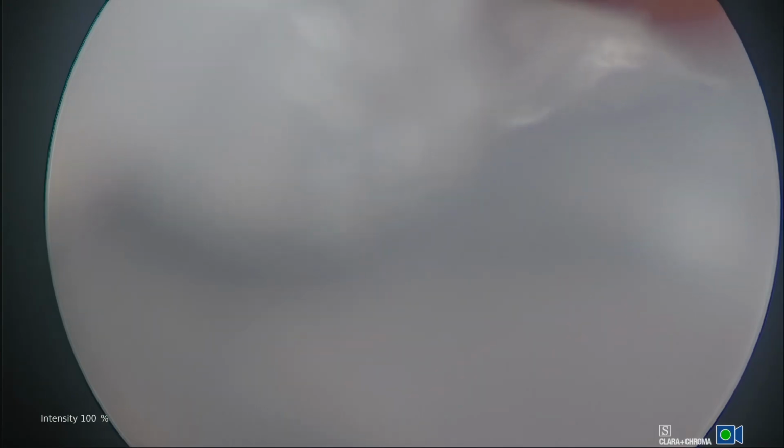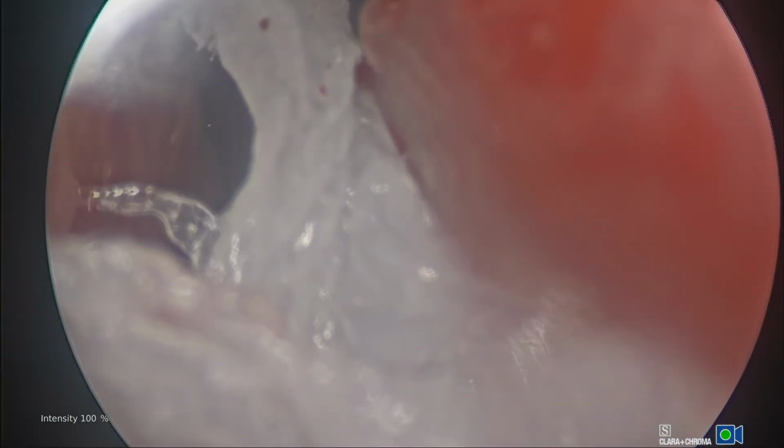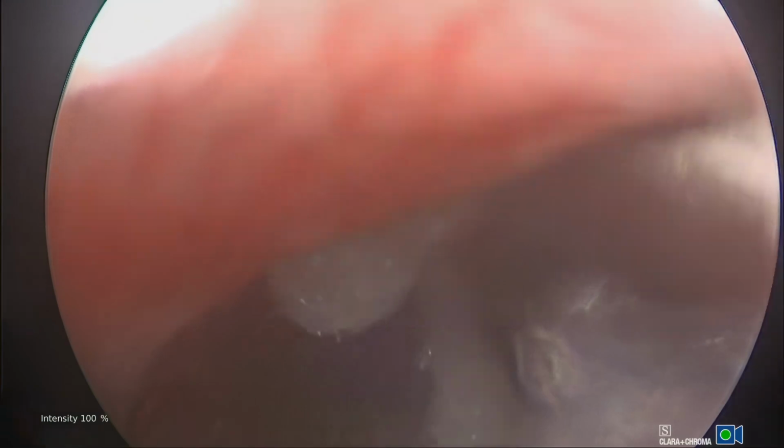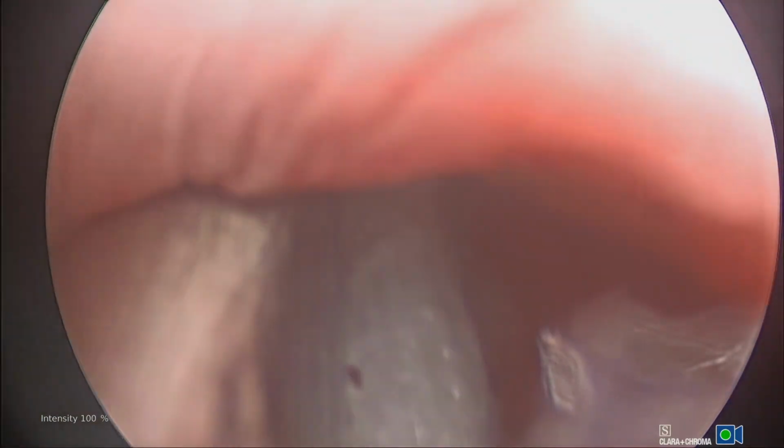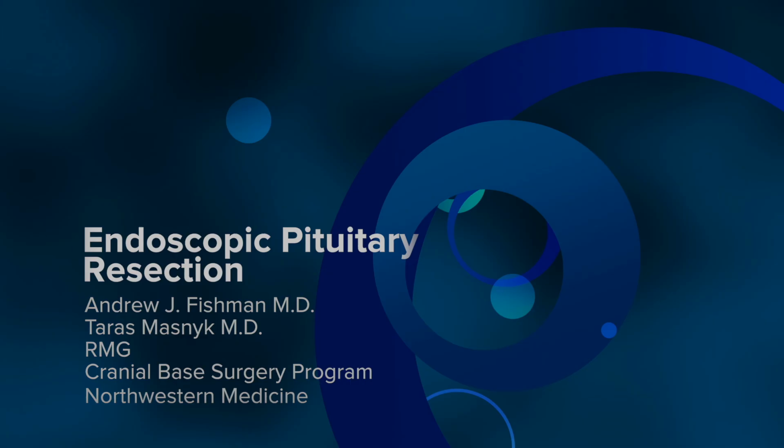cavity to allow for a good, nice opening of the nasal vault during healing. If you rely on dissolvable packing, the healing tends to be delayed and the patient usually requires a prolonged period of debridement. While using this dual flap technique to cover all of the fat and to provide a nice open supported cavity, this minimizes the need for post-operative debridements.